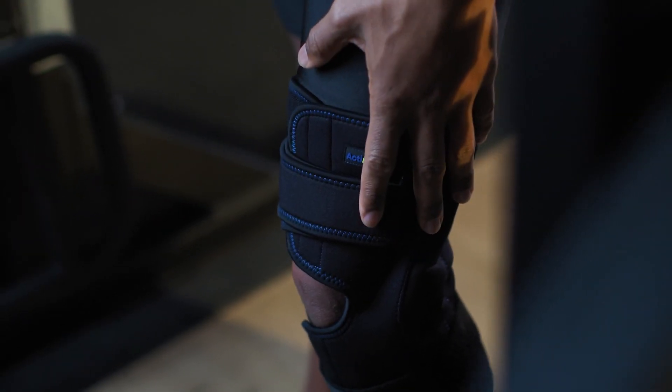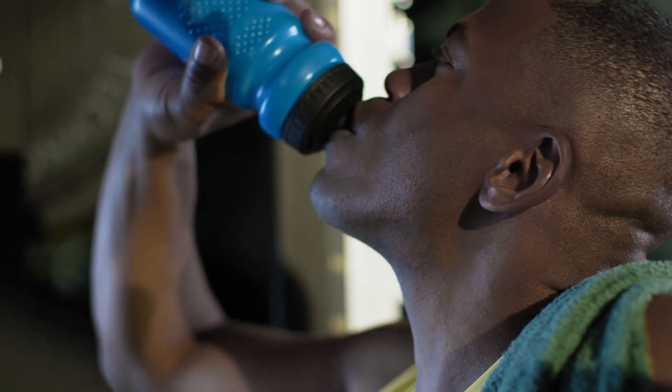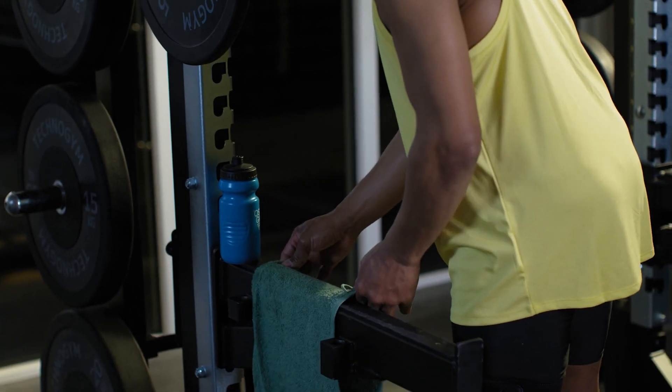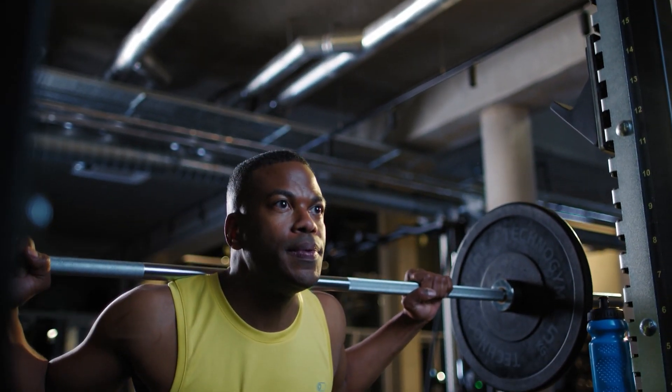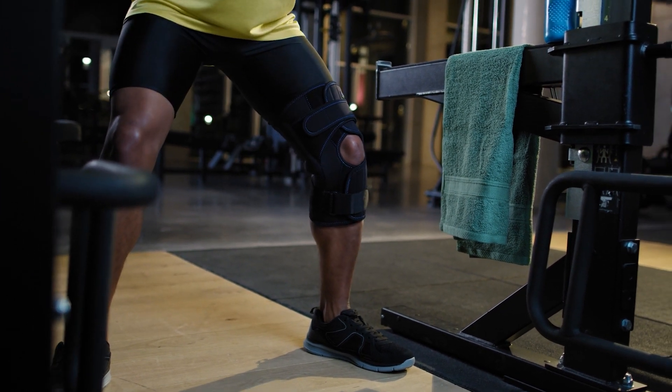Actimove knee brace wraparound with polycentric hinges is specially engineered to help pain relief. Medical compression and balanced therapeutic warmth comforts the knee with a fully adjustable front wrap closure system specially constructed with Coolmax air technology for breathable comfort and cool dry sports.